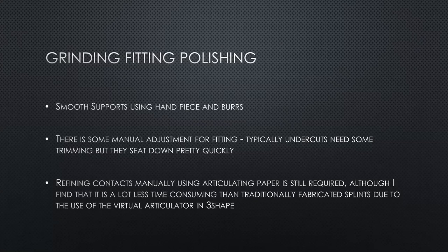And finally, I'd fit check and refine the contacts, for example, on a denture or on a splint, and finally pumice and polish as needed. So finally, I just want to leave you with a few tips and tricks before we wrap up and move on to Q&A.